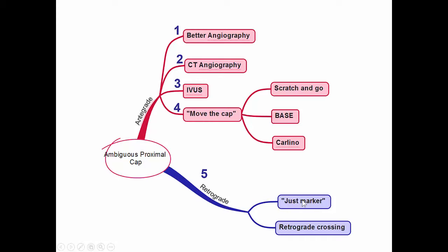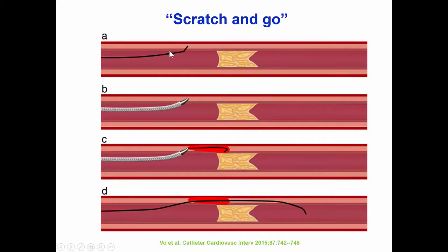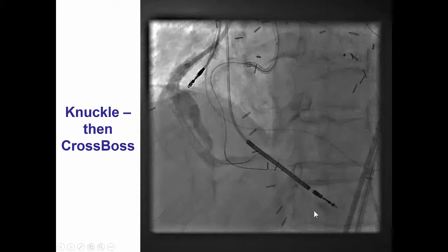Retrograde was not possible in this case, and CT angiography was not helpful — we did not have CT angiography, and there was no large enough branch to do intravascular ultrasound. This is how the scratch and go technique works: a wire is advanced into the adventitia proximal to the proximal cap, then a microcatheter is advanced close to the track created by the wire, a polymer-jacketed wire is advanced to create a knuckle, and then subintimal crossing of the CTO follows.